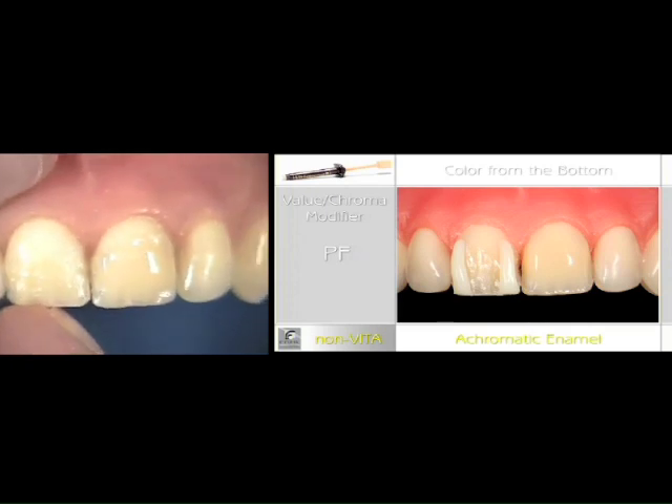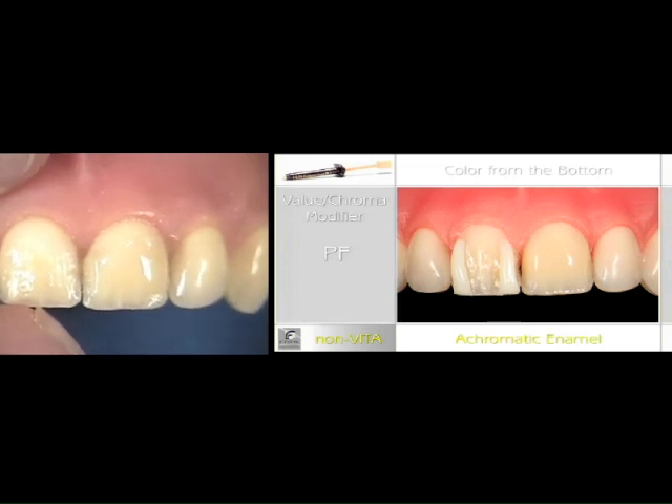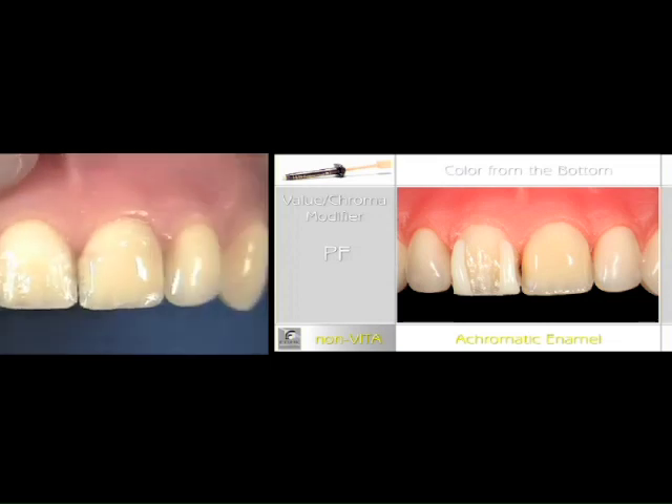I'm going to use pearl frost and transfrost to bring that A3 to the A2. Pearl frost will modulate it more — it'll make it less saturated than transfrost because it is higher in opacity, and it will be used over the lobes, as you see on the right screen.